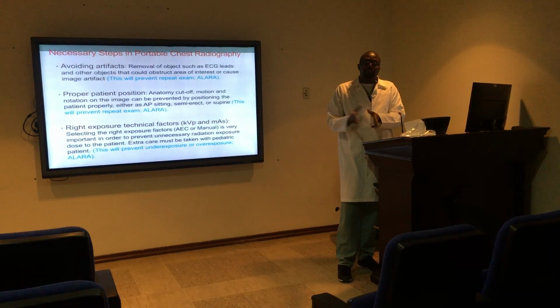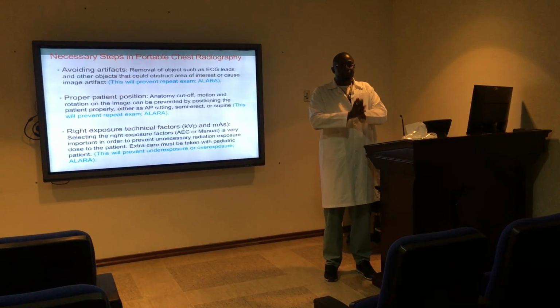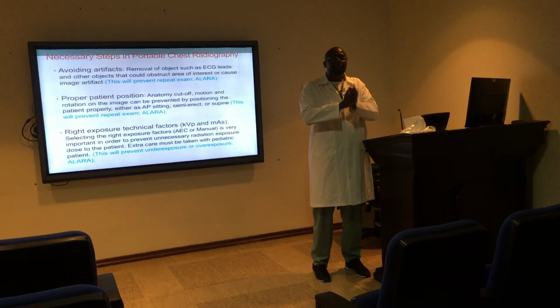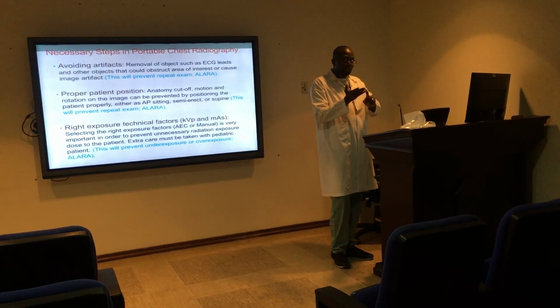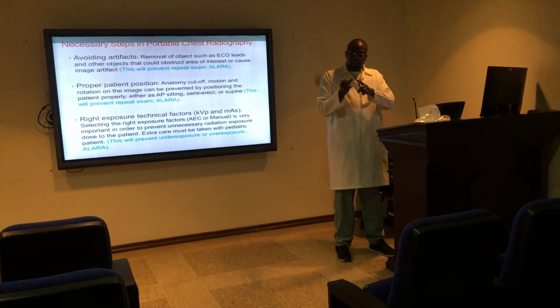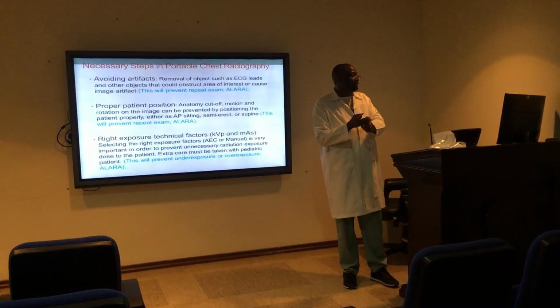The next is positioning your patient. This is a very critical step, because if you position your patient right, there's a high chance you are going to be obtaining a quality image. With the proper positioning, there will be no anatomic cutoff, no motion on the image, and no rotation.